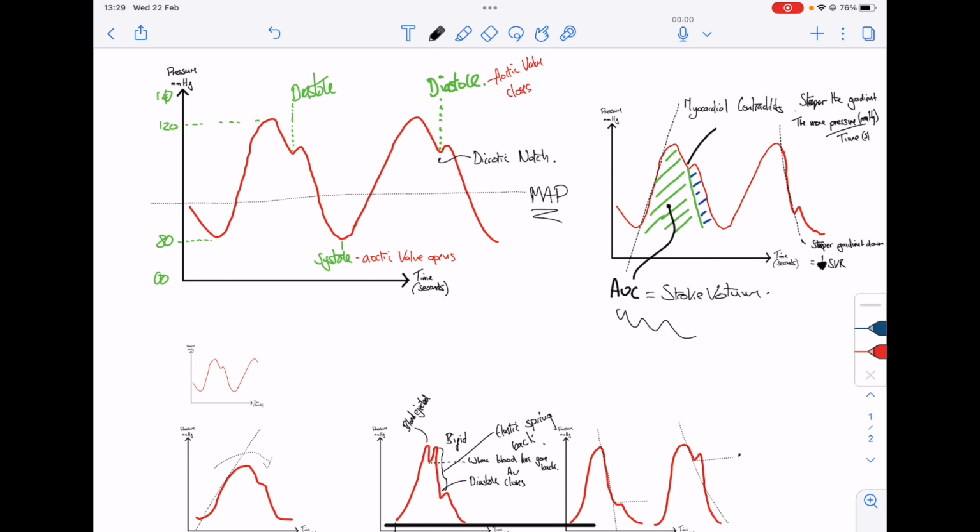But broadly speaking, you would say, yes, using Fourier transformation, the systolic component of the arterial line waveform is broken down and its area calculated. This is used to look for stroke volume variation and enable cardiac output monitoring, and further information can be gained in SVR. And hopefully, by the time you've said something like that, the examiners will be thinking about the next question and you'll have got all the points.